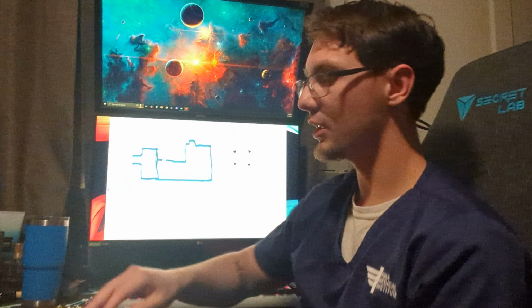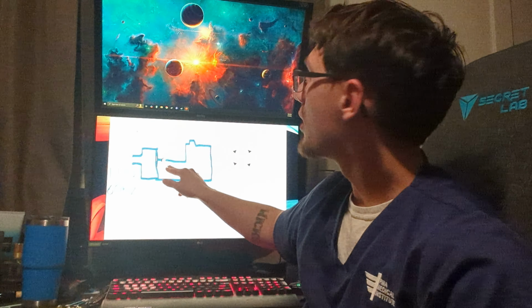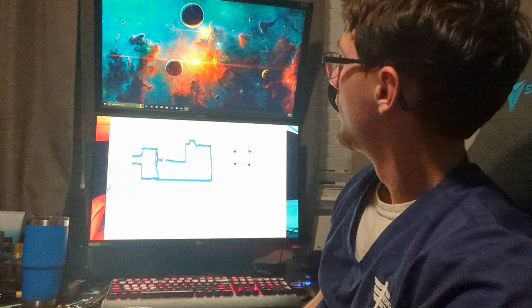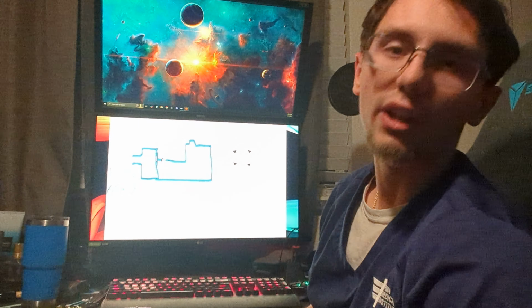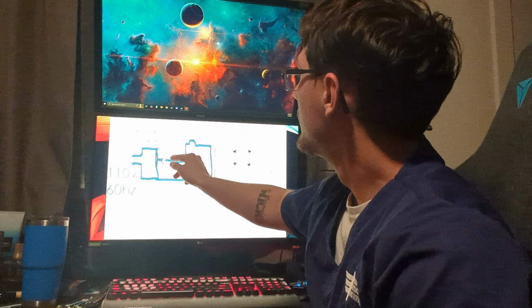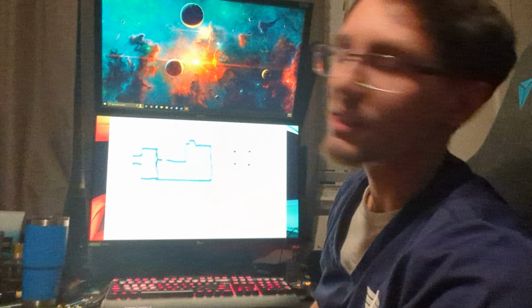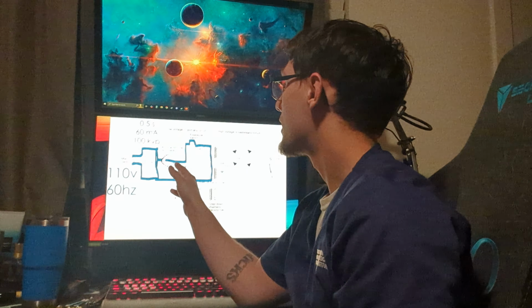Your auto transformer will use a moving selector hand that will line up with one of these dots, and each one of these dots will represent a different kVp amount. So for demonstration purposes, let's say that this center dot here is 100 kVp. So like 20, 40, 60, 80, 100, 120, 140, etc. Another huge thing to note with this auto transformer is that it uses induction.